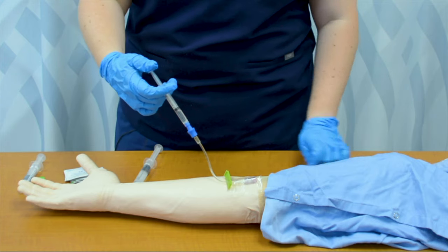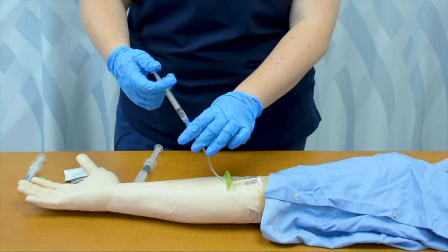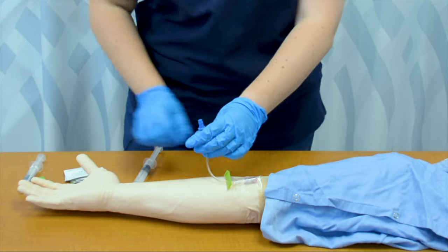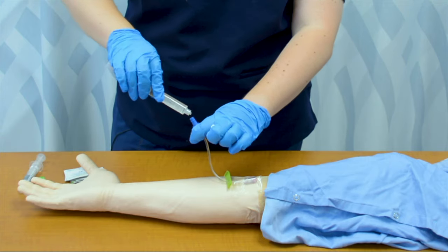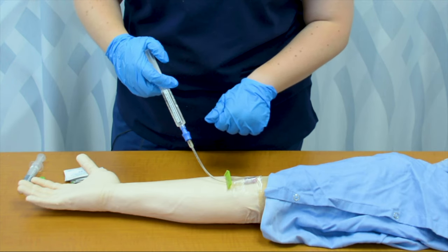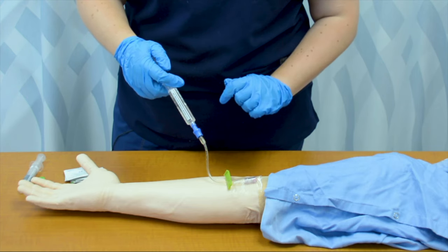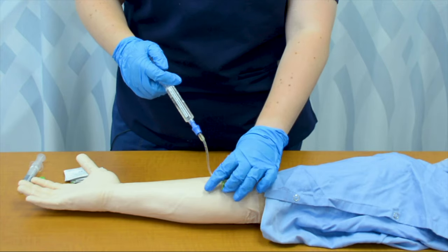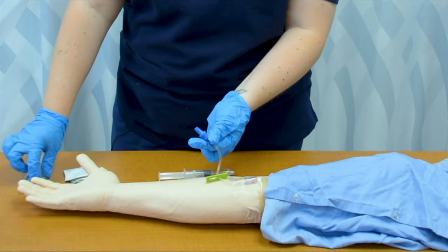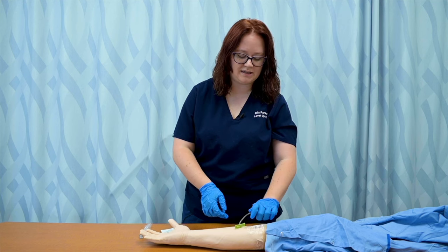I then connect my medication syringe and I push that at the recommended rate that I can retrieve from a drug textbook or online or from my pharmacy. So I'll push that at the drug recommended rate. And I need to follow that up with another flush of normal saline, about 3 to 5 milliliters, just to make sure I've cleared the medication from this extension tubing. I'm pushing that at the same rate that I've pushed that medication. Once I'm done with my saline flush, I can go ahead and lock my saline lock, remove my flush, and then I'm going to reapply my cap if I use disinfectant caps in my facility. And your patient's now received their IV push medication.